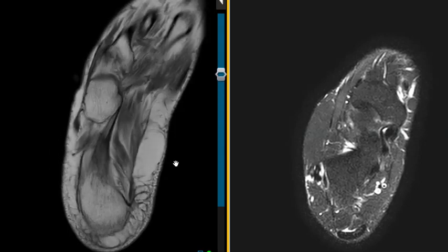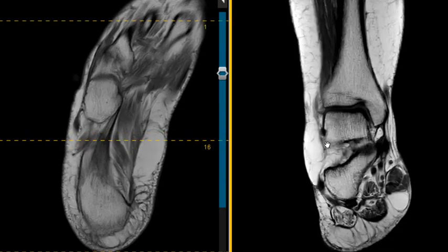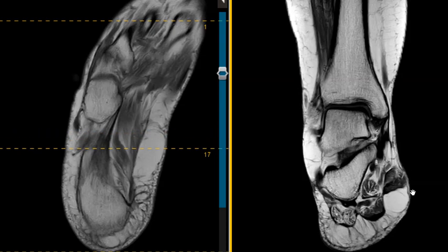There it is. Right over here, this is a pretty common place to get a collection of fat that doesn't have the normal fibrous strands supporting stroma. This is just a big round collection. So I have seen some radiologists will say, hey, there's a lipoma here. But I've seen these so often in patients with no complaints that I think these are just asymmetric loculations of fat rather than lipomas. So here's one right here, so clean.